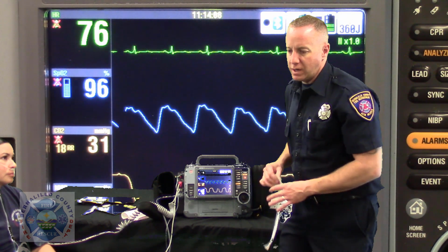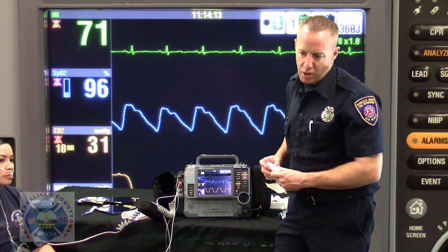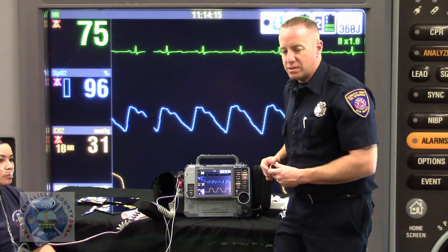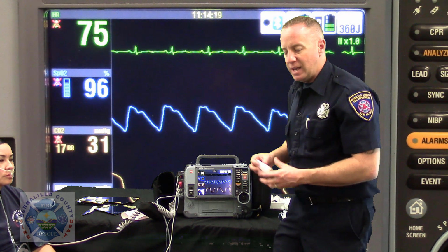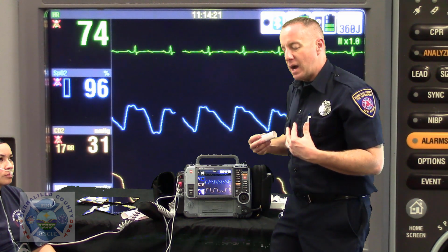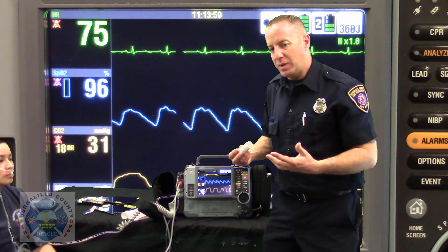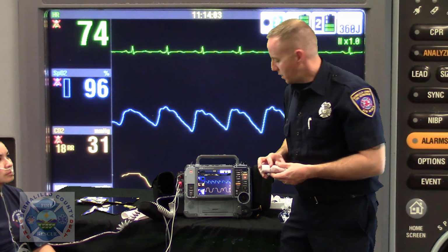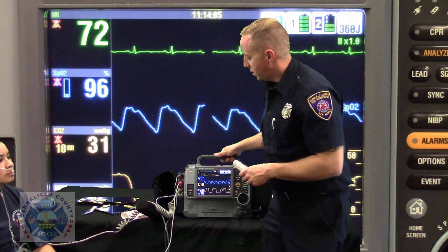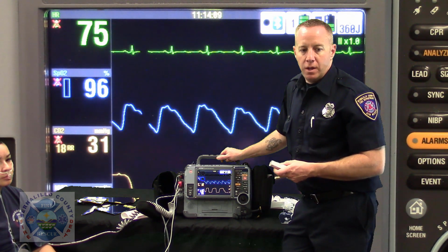And I know we all get kind of worried about, what if I made a mistake, or what if I did something out of order? We're humans and we make mistakes. That's one thing about the monitor and using it in this configuration, is that it has the ability to highlight when we're having some shortcomings as a department, and that way we can roll out some corrections as needed. So I highly encourage you to get used to using all of these event wheels as well.